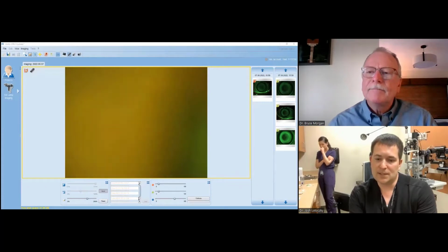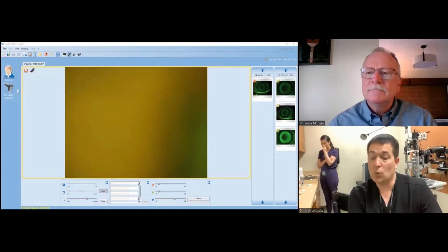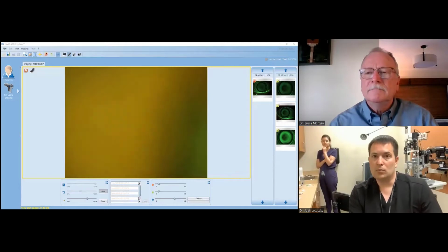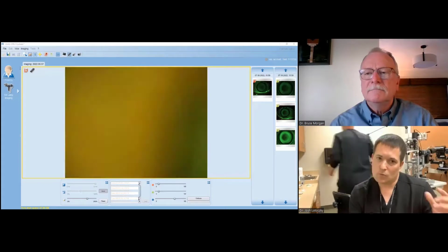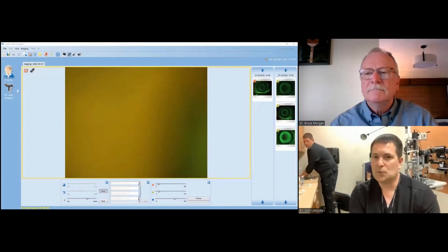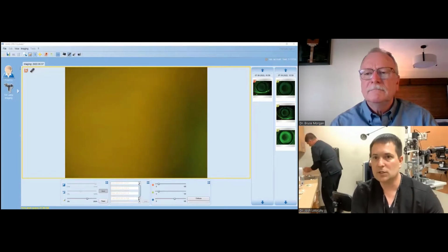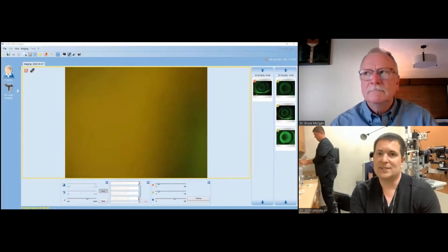Most of the time, again, since we know that eyelid is going to push it down, we're not as concerned unless we start seeing on their follow-up visits that it is decentered inferiorly when they sleep. Because to us, it's definitely more important how that lens is sitting when they're sleeping rather than right away in that slit lamp. So that's where a lot of times we do have to manually center those lenses and say when it's centered, it looks like the exact pattern that we want, even though it looks as though it's decentering inferiorly while the patient has their eyes open.